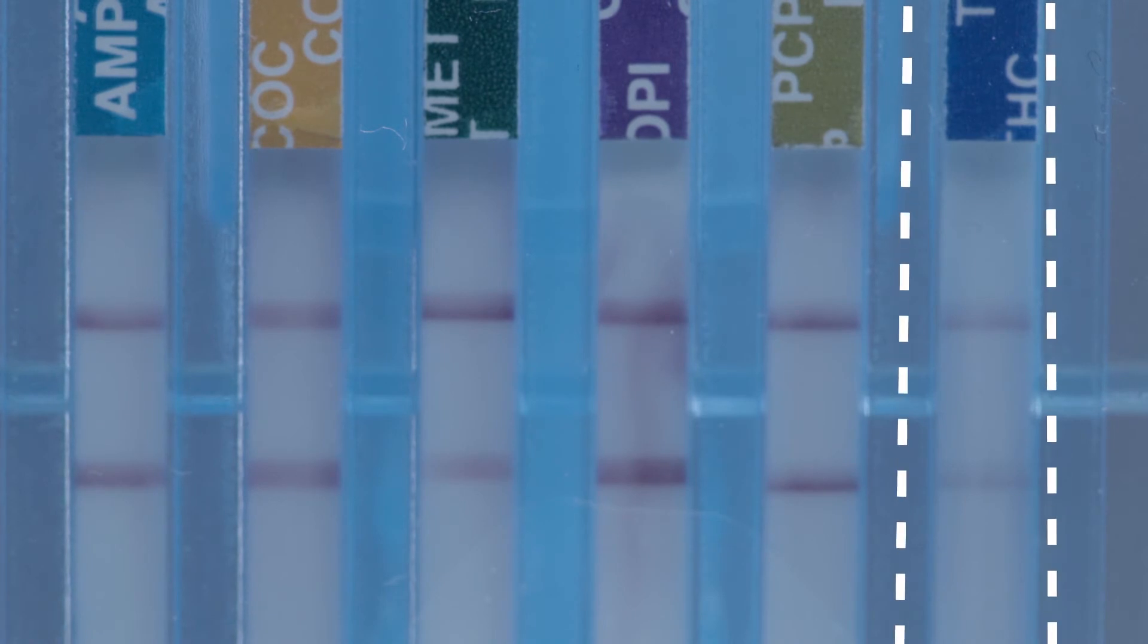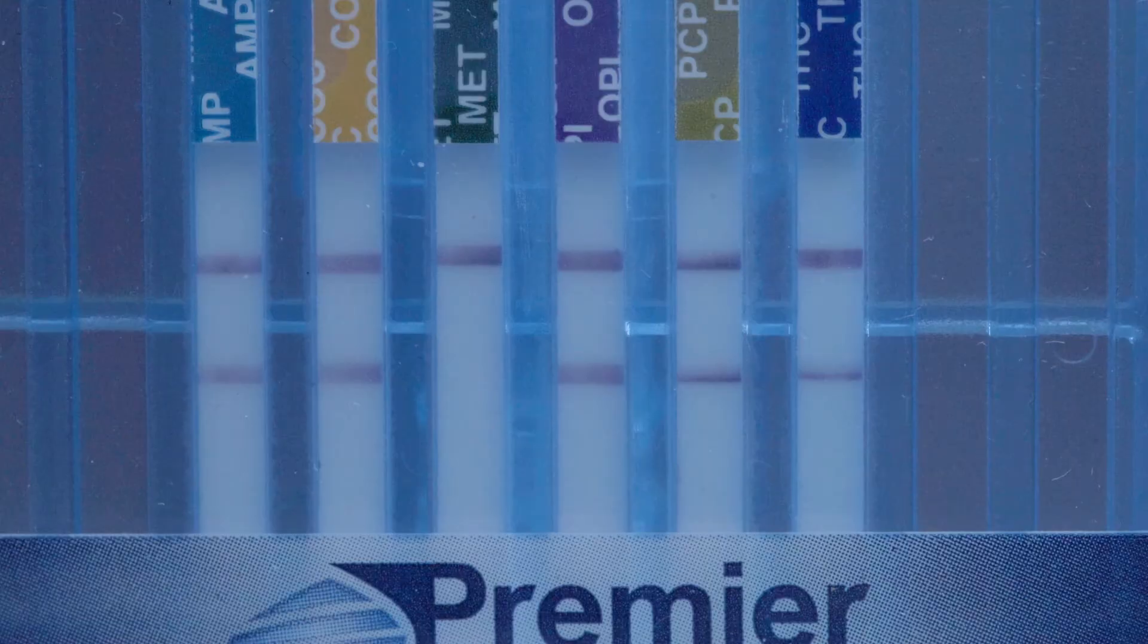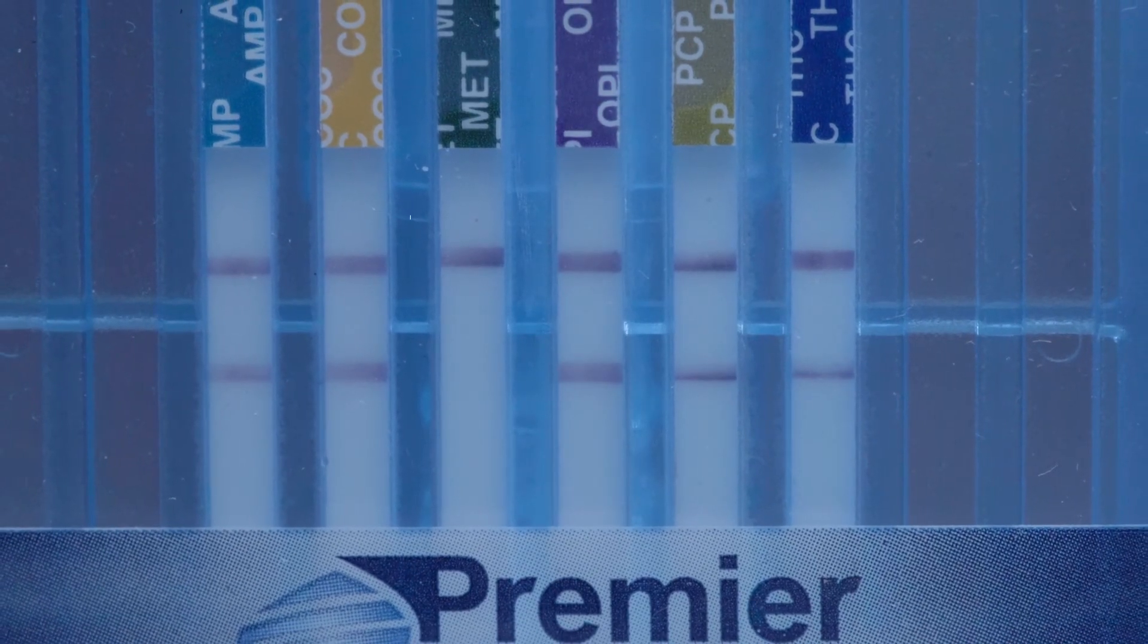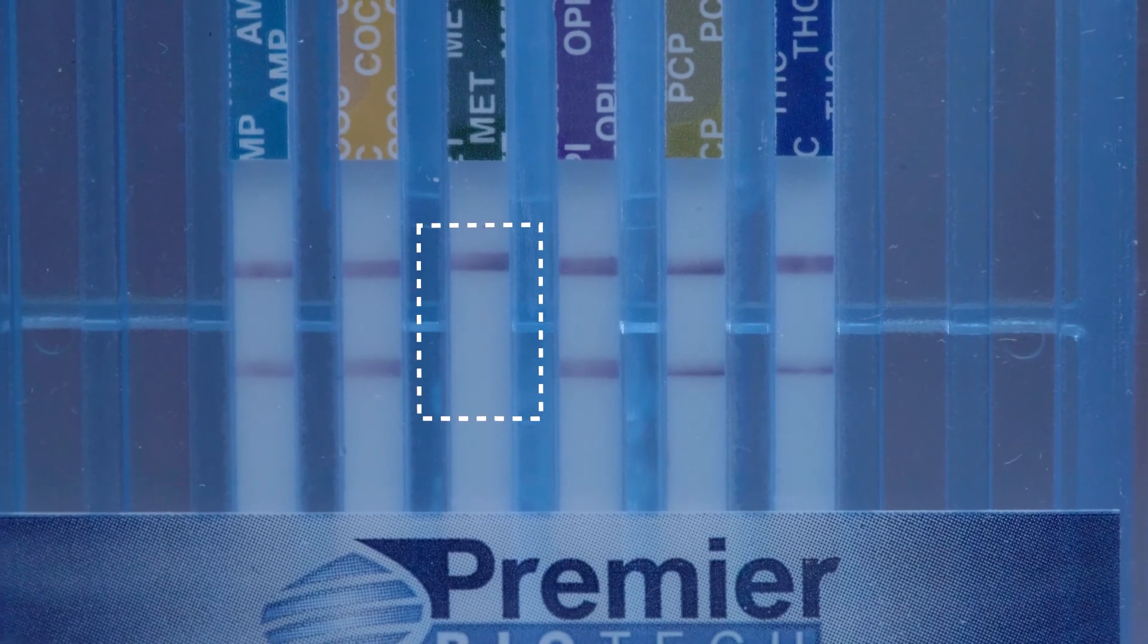It is normal for THC to run slower than other test strips. A presumptive positive result, as seen in this example, is indicated by only the top control line present and the absence of a bottom test line.